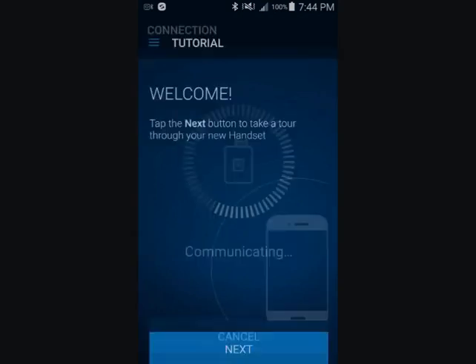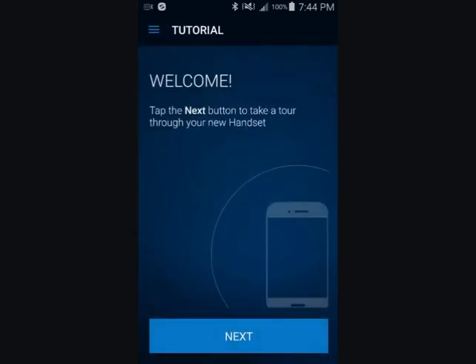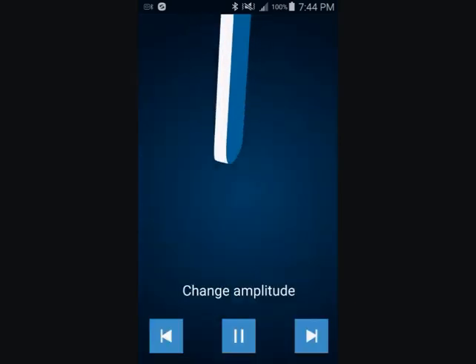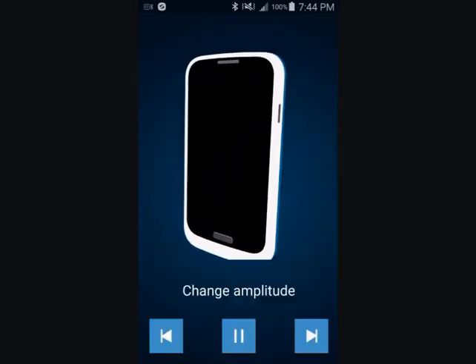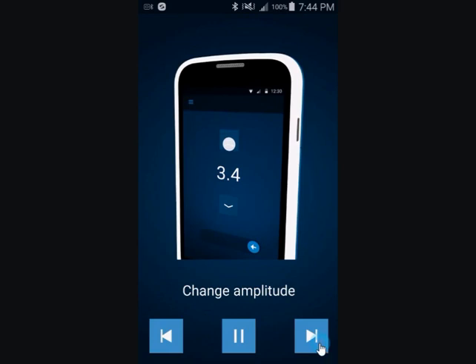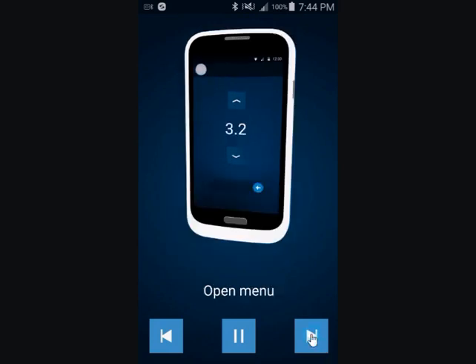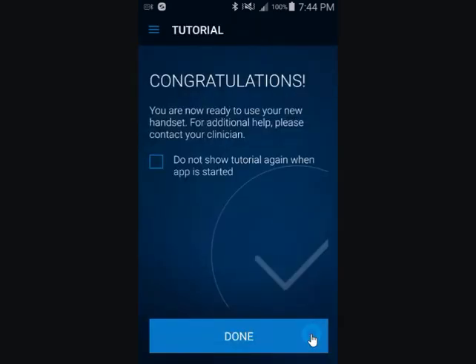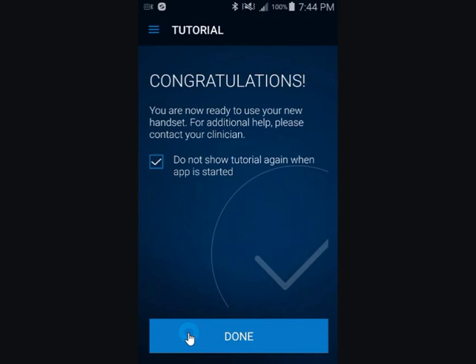Tap Next to start the tutorial. Tap Forward to advance through the tutorial. It is not necessary to view the tutorial every time the MyTherapy app is opened. At the end of the tutorial, you can check the box for Do not show tutorial again when app is started, and then tap Done.